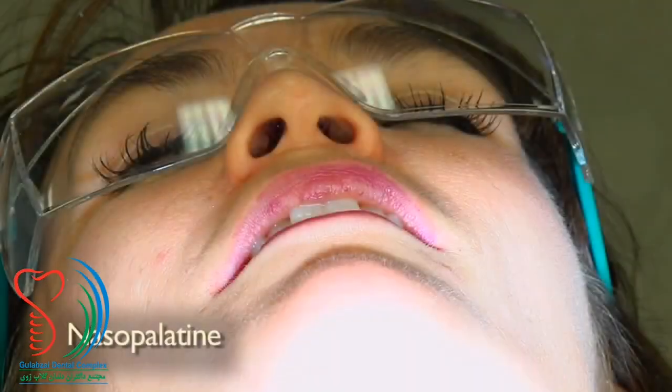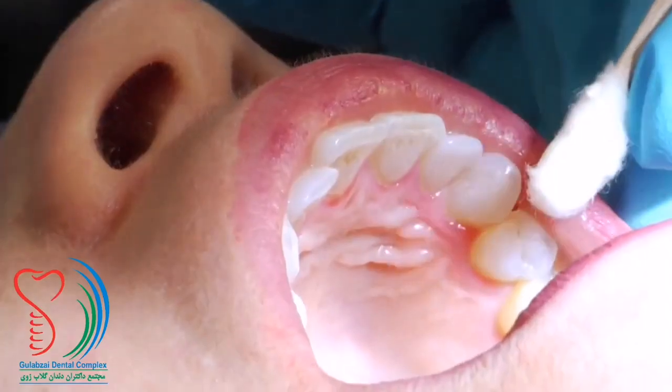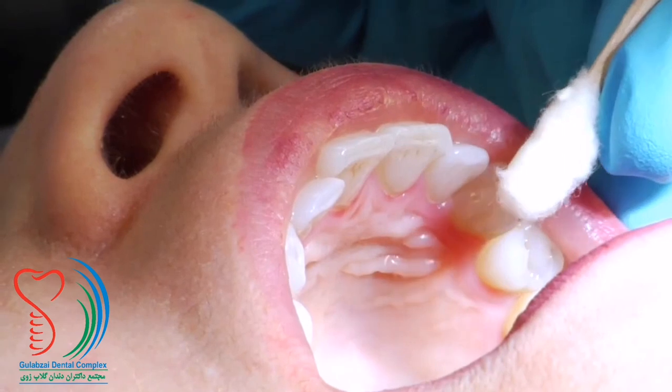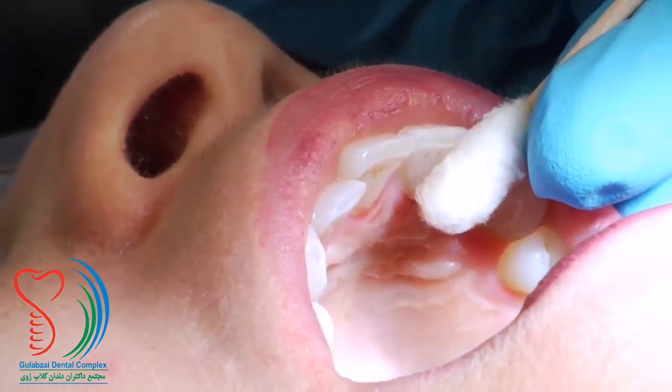The nasopalatine is done in a similar manner. The insertion point for the nasopalatine is at the junction of the incisive papilla and palatal tissue on one side or the other of the incisive papilla.